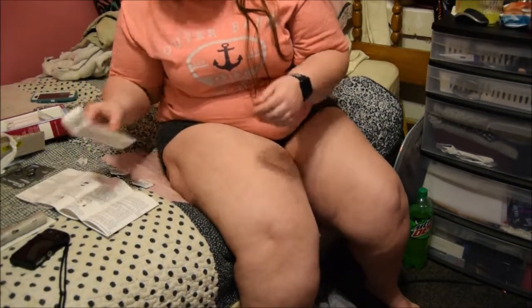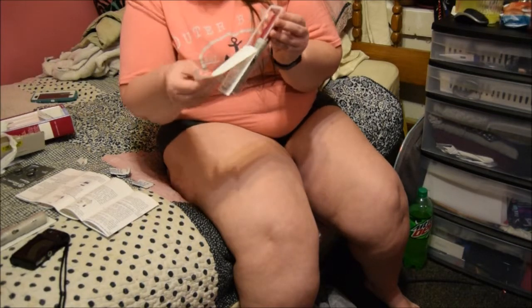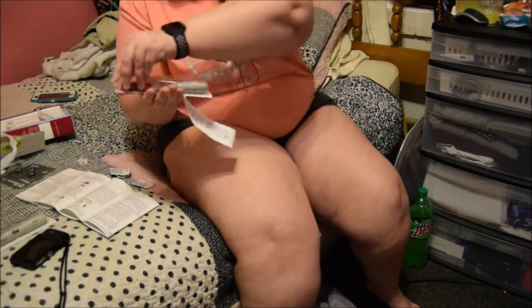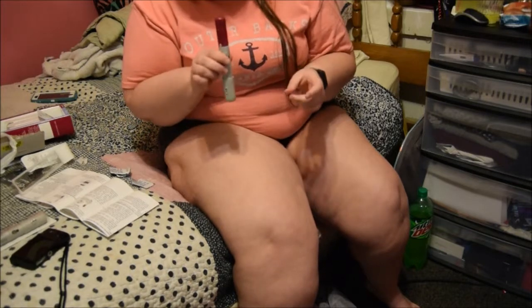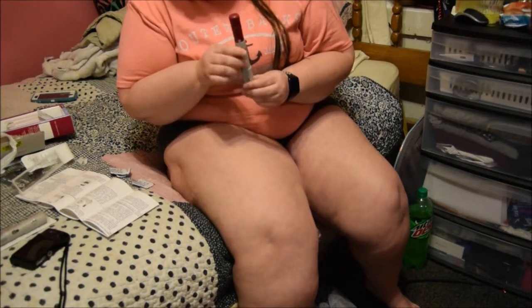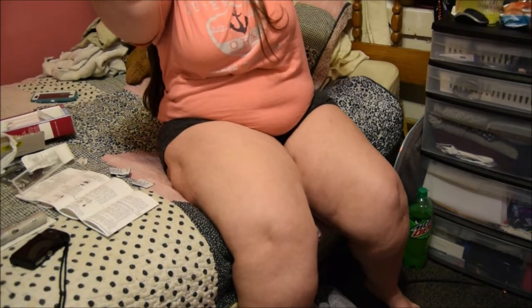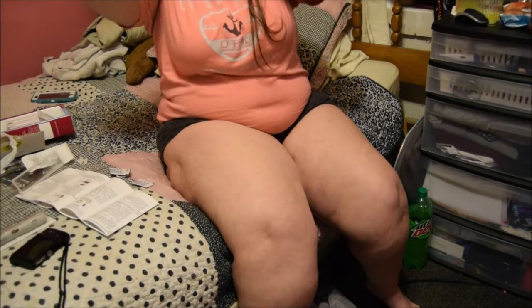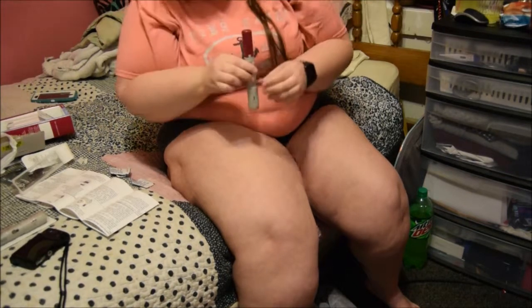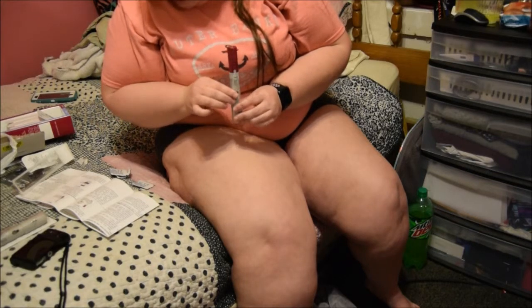Okay, now I'm going to open my pen. So I'm going to open it very carefully, just like that, and take it out. It says hold pen with the gray cap down. Make sure the amount of liquid in the pen is filled to the line, which it looks like it is. Yeah, it's filled past the line. The pen does not have a full amount. Do not use that pen.